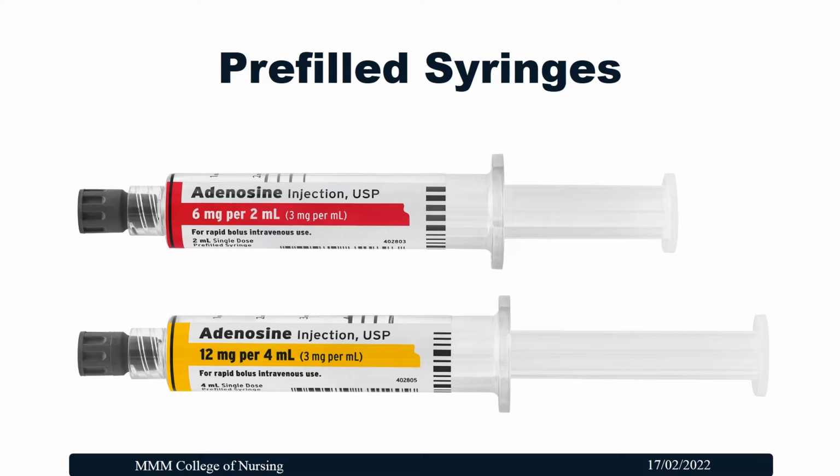There are syringes readily available with the loaded medication. Here we can see the medication name, dosage, amount, everything is labeled on the syringe. It is readily available, we just need to fix the needle and we can inject the patient according to the dosage required.